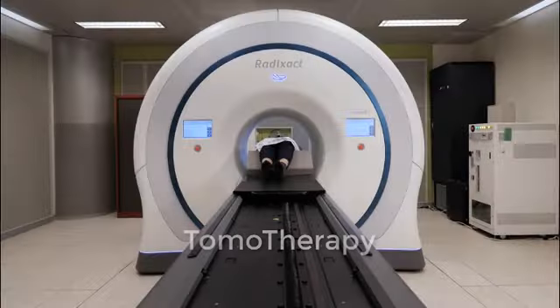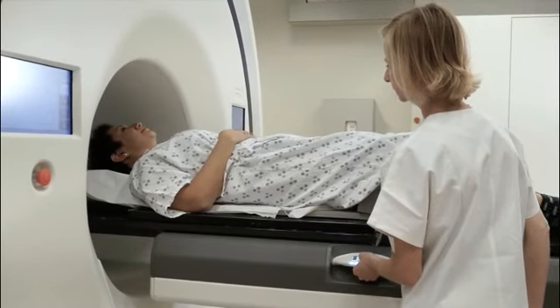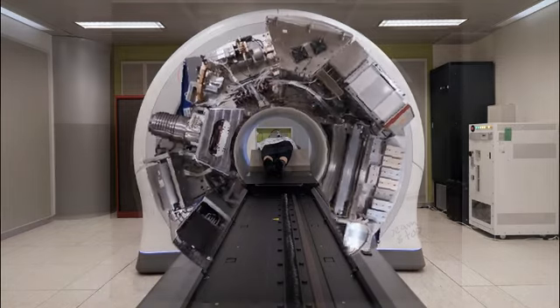So far, what I've been describing is IMRT as it's delivered on these C-arm gantries that are in common use now, but there are other methods for delivering IMRT, so let's look at those. This is the tomotherapy unit. We looked at this in video 9.2, so you can go back and review that if you like. This is sort of a donut. The patient slides inside, the unit rotates around and delivers dose as the patient slides through.